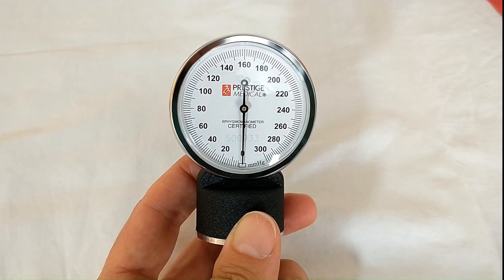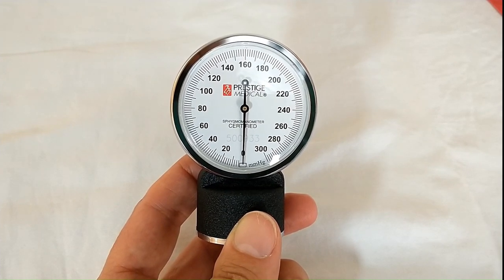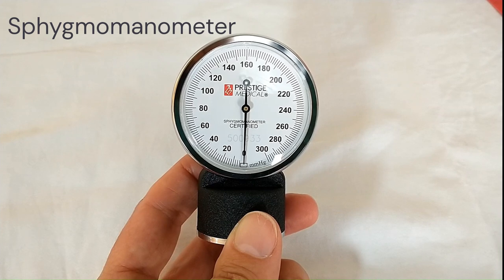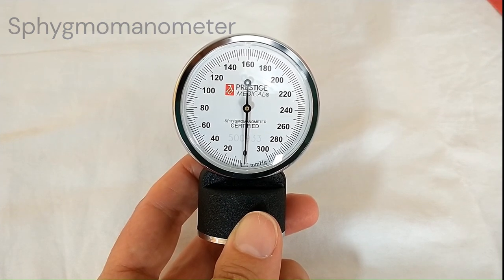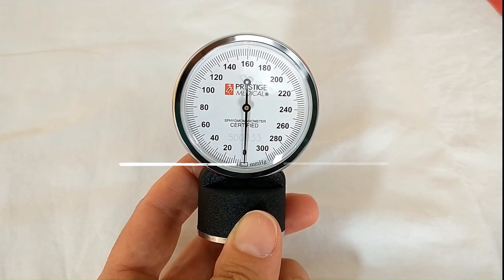The other part of the blood pressure cuff is the actual sphygmomanometer, so the actual device that will give us the reading. As you can see here, it goes from zero all the way to 300.